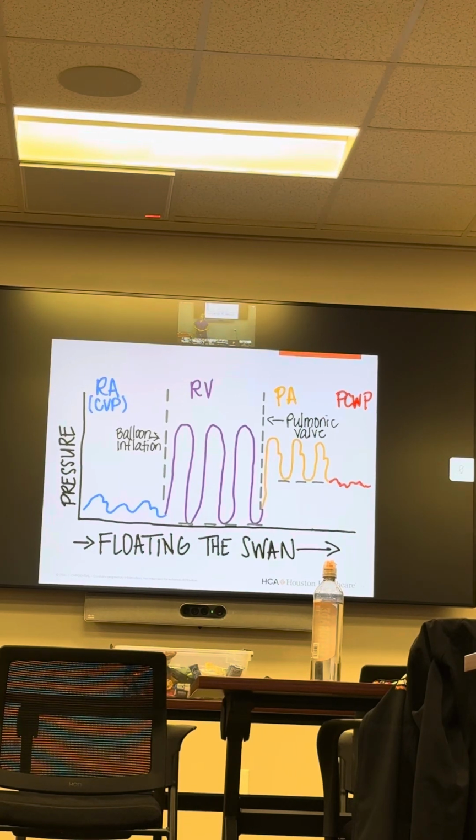Now, one thing to note though, is we can't wedge. Without a physician at the bedside, we cannot inflate the balloon. So then Karen, what did you tell me all that for if that's for nothing? Because we can trend our PA diastolic, you see how close that is? We can trend our PA diastolic to inform us of our wedge.